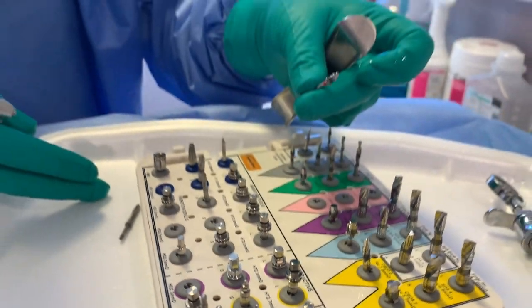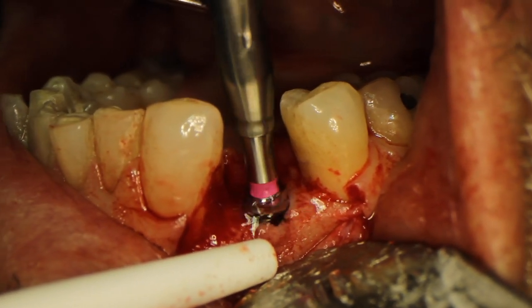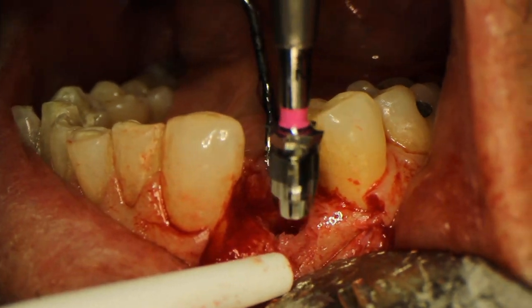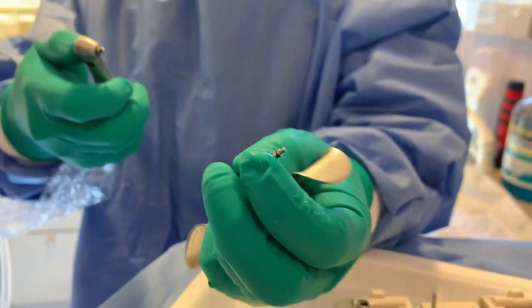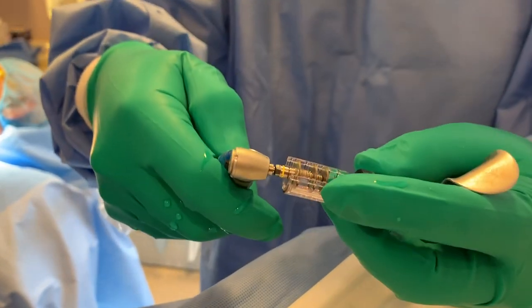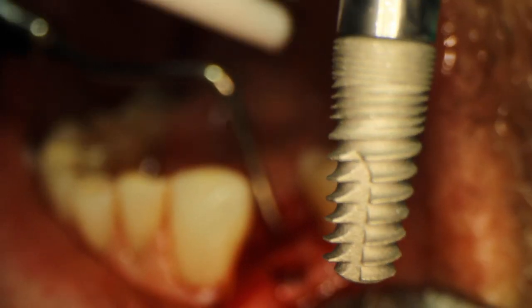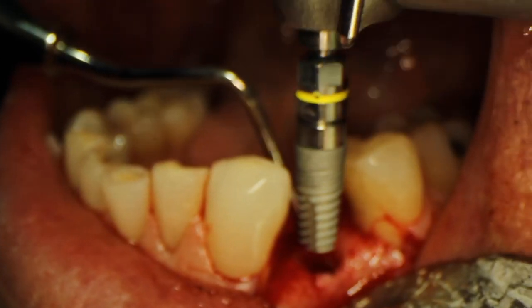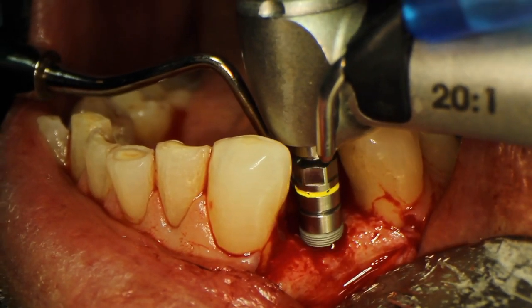I'm using my last drill, which is undersized about 0.7mm, and I'm taking it to the top of the black line which corresponds to 10mm. After the implant drills, I have to use the bone profiling burr. I'm using this bone profiling burr to create the profile right at the crest of the ridge — if you don't use this, you're more likely to get a spinning implant. Now I'm using the insertion tool, picking up my implant from the case. This is what an Implant Direct interactive body looks like — fairly aggressive threads with a conical connection. Implant Direct has different implant body types, but the interactive implant has that conical connection.